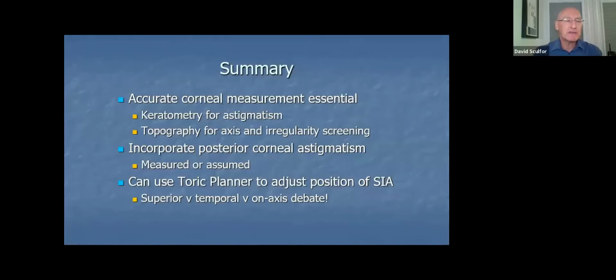It's absolutely vital now to incorporate posterior corneal astigmatism, and all the online calculators will do that. So Alcon, for example, changed theirs probably 2, maybe 3 years ago. Prior to that, it didn't incorporate posterior corneal astigmatism. With Zeiss, you can switch the algorithm on and off, so you can choose not to have it calculated. Why you would, I've no idea.